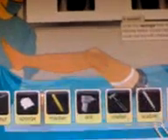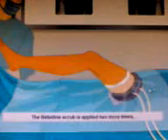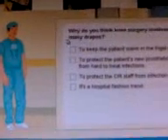To kill the bacteria on the patient's leg, clean it in a betadine solution. This scrubbing process will limit the chance of bacterial infection. Betadine scrub is applied 2 more times, followed by the final arrangement of sterile drapes. Why do you think knee surgery involves so many drapes?